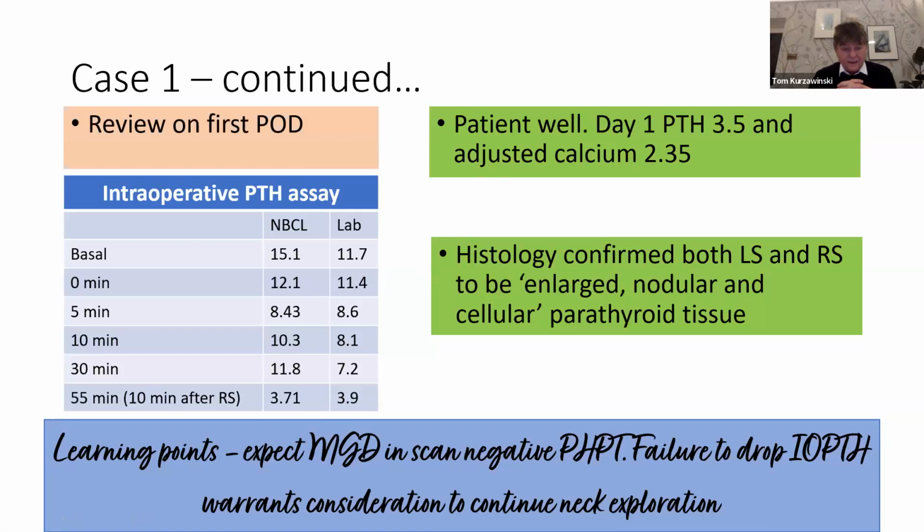You don't have to see the gland and touch it. Just retracting the lower lobe of thyroid with a gland somewhere there will also increase it. So take it out, and you have to allow the 5 and 10 minute samples to be taken. You just have to sit on your fingers or walk away, and then come back for checking hemostasis and further exploration. I think it's a very important point, Sam.